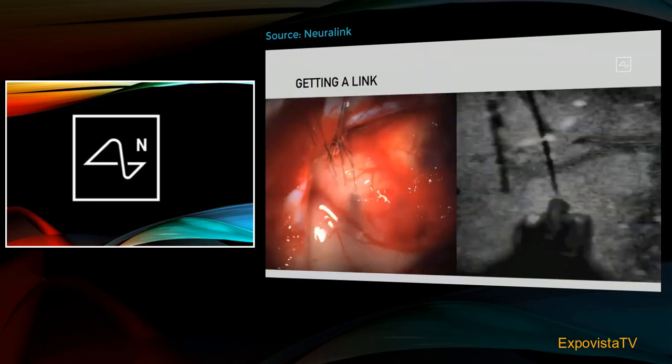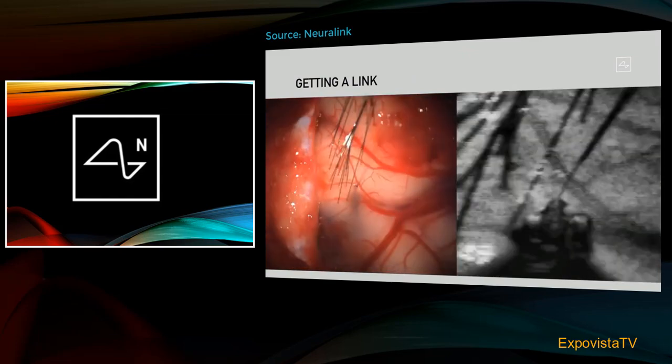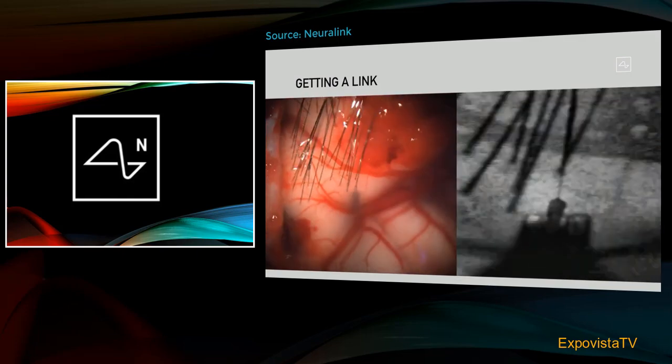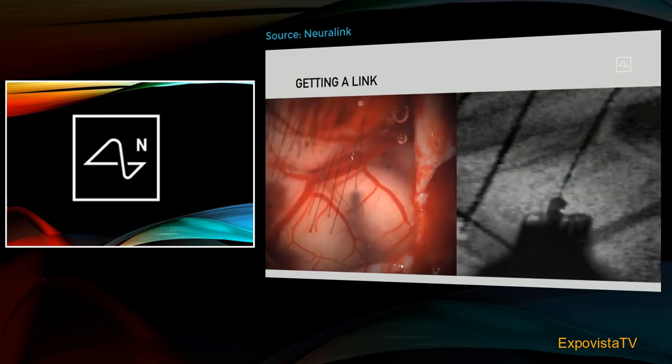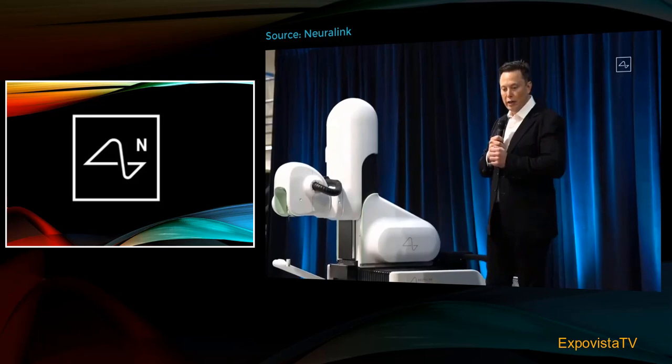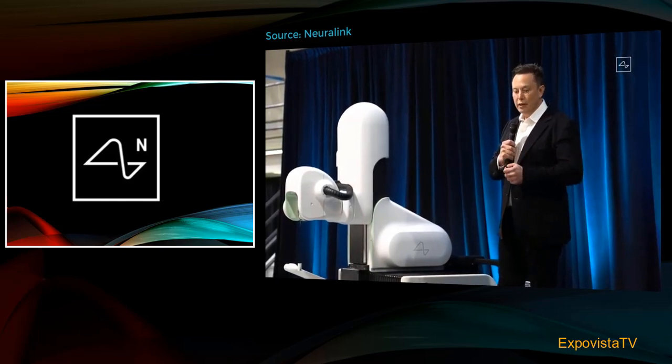This shows a close-up view — not too gruesome — of the electrodes being inserted in the brain. If you look closely, you'll see that it's a little counterintuitive: if the electrodes are inserted very carefully, there is no bleeding. If you have very tiny electrodes inserted very carefully, the robot actually images the brain and makes sure to avoid any veins or arteries, so that the electrodes can be inserted with no noticeable damage. At a really small scale, stabbing something with a wire does not cause bleeding.